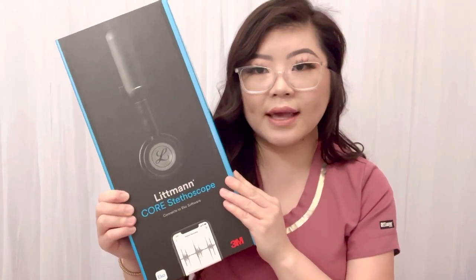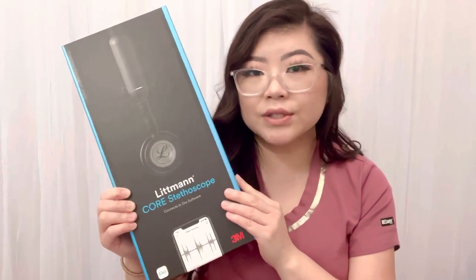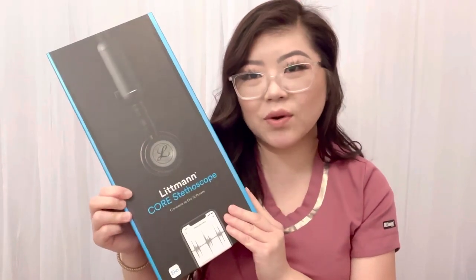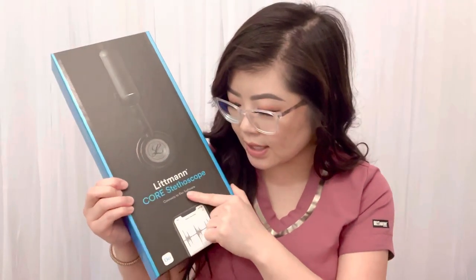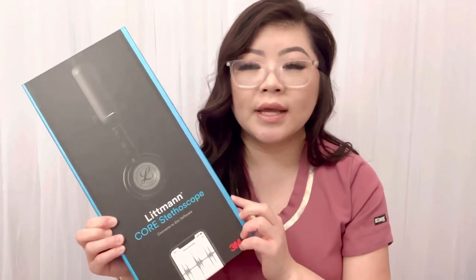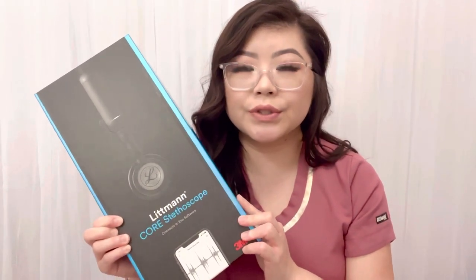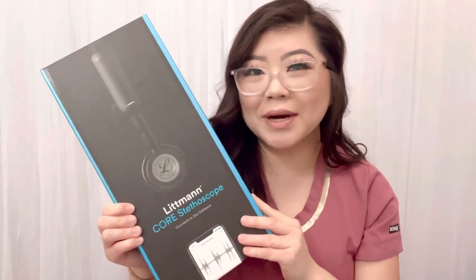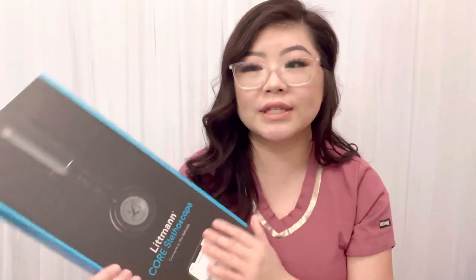It just barely came out — I believe 2022. It has a lot of functions and it's equipped with technology. It also allows me to record the heart and lung sounds. The Littmann CORE stethoscope connects to the Eko software, which is an app you can download on your phone. This enables you to record the heart and lung sounds and listen to them better. If you want a more in-depth review, please check out YouTube.